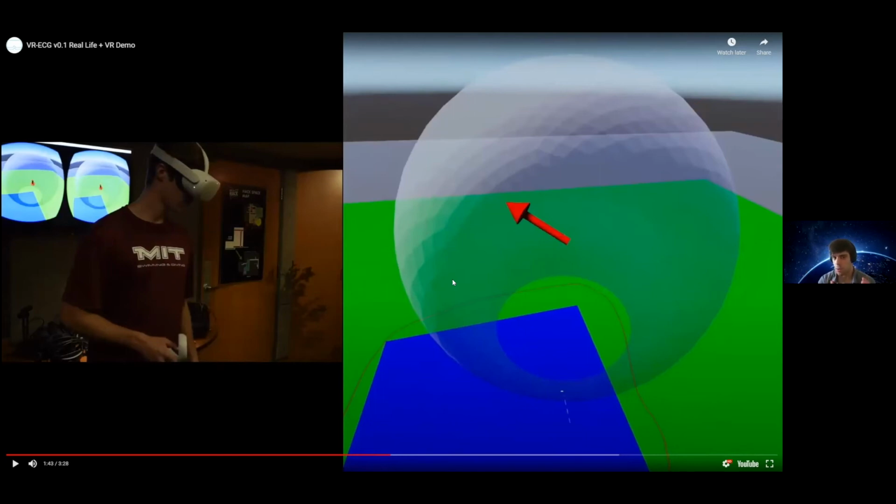The primary one for diagnoses, the primary one for understanding EKGs, is the electrical activity one. But the depolarization vector as visualized here is still taught in classrooms. It's just not the way the instrumentation works.